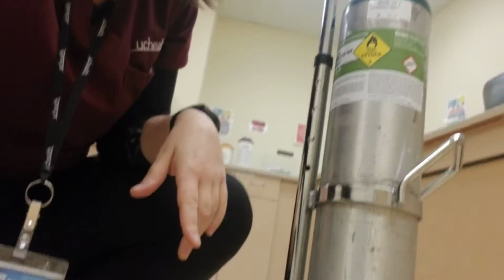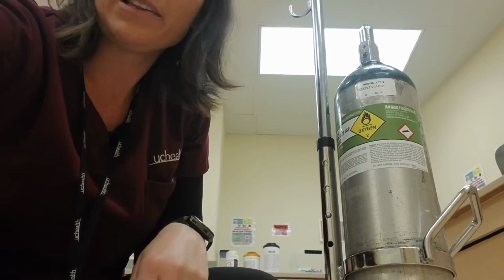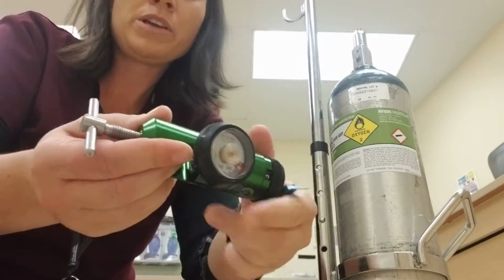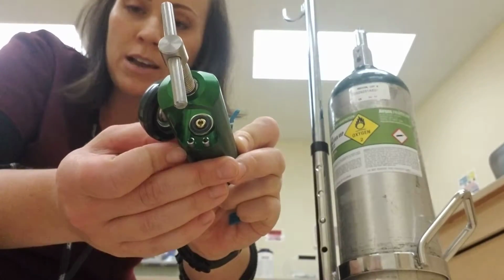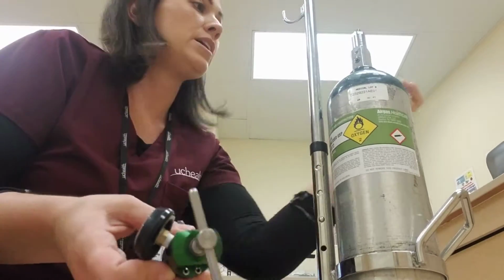Okay, so I'm going to show you here how we hook up a regulator to your oxygen tank so you can use it. Here we have an oxygen regulator. We use a pin index safety system, so you can see the two pins here and O-ring, and that's going to connect to the top of your oxygen tank here.